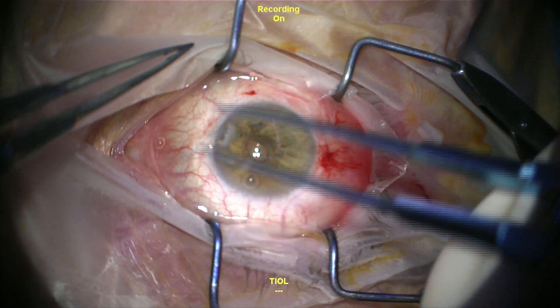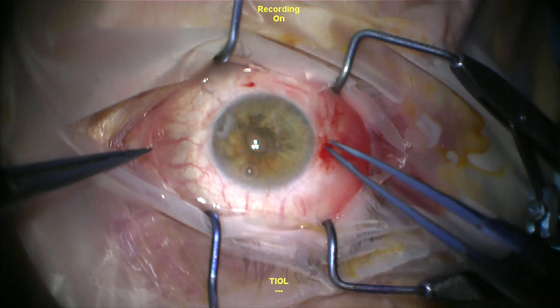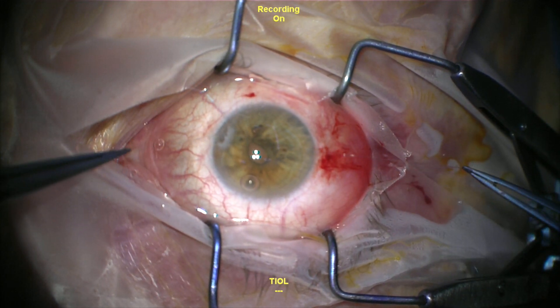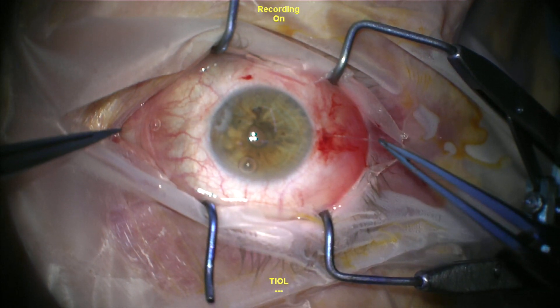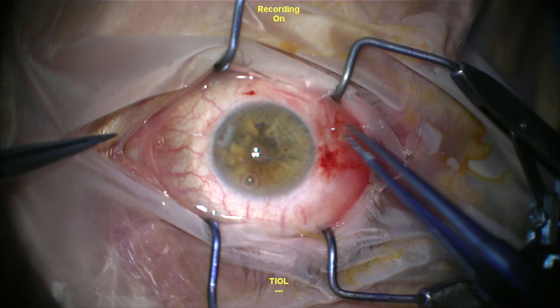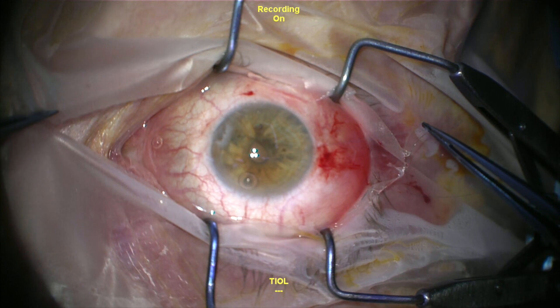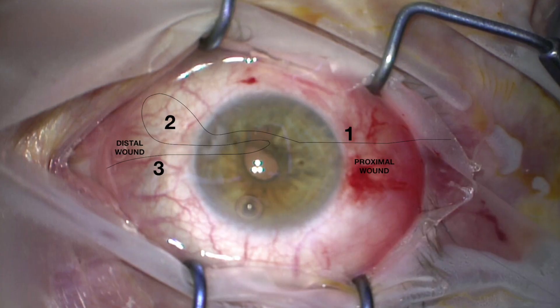Then simply pull your loops over part three of the suture, as you would with any other surgical knot — though obviously you're not pulling a knot tight like you would in a cornea. From this step, hold part three of the suture and go back to part one and slowly but gently pull the suture back through the proximal wound in the cornea. Once the knot is tied nice and tightly and is firm on the iris, you've performed the first and most important part of the 3-1-1 knot.